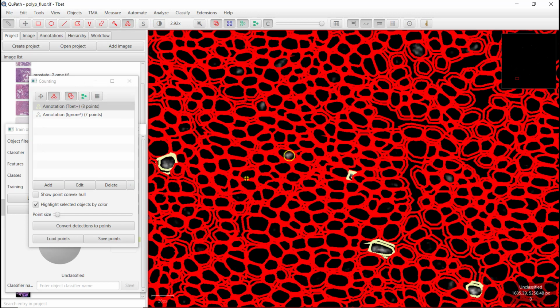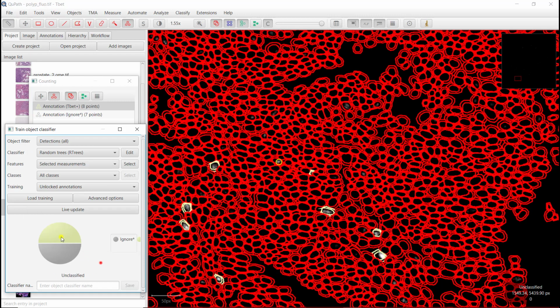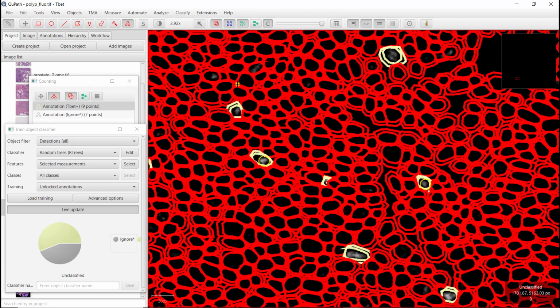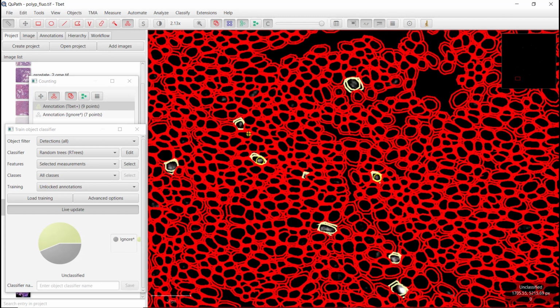It might add other ones. No, it didn't change. So it's, oh, live update. I put it off and switch it off again. I don't know what I did. Let's see if I add this one, for example, does that change? Yes, so it adds the other ones. So then I need to see if this is real. It probably is.